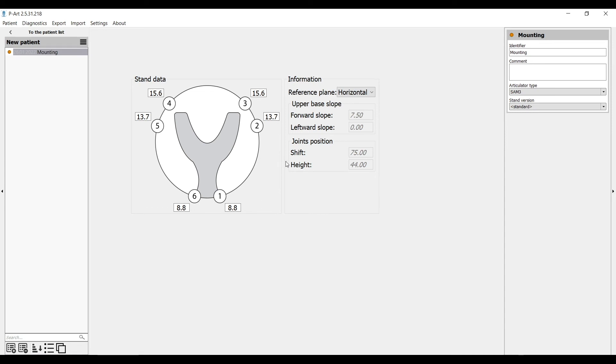Now we need to take the rack, it has six guides which are numbered. We need to adjust each of them and we will get individual positioning of the upper cast. We place the rack in the articulator, then place the bite fork with silicone and mount the cast.